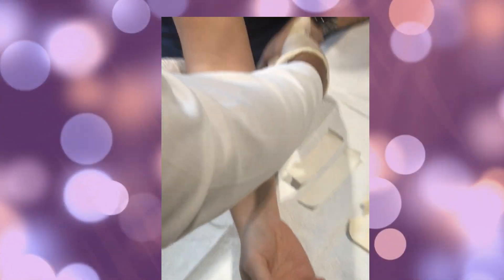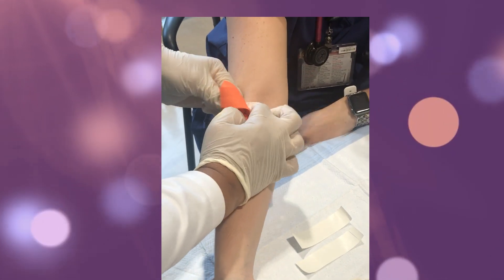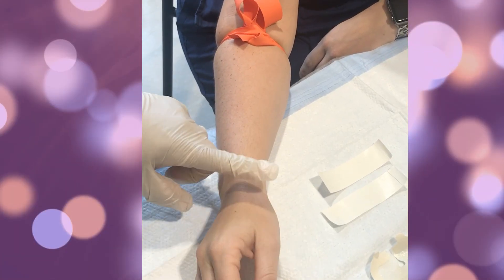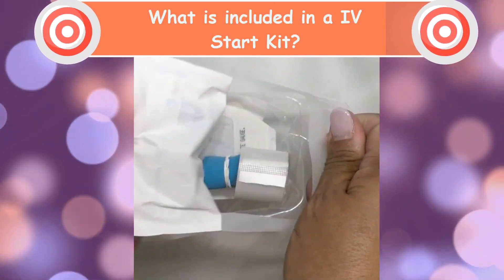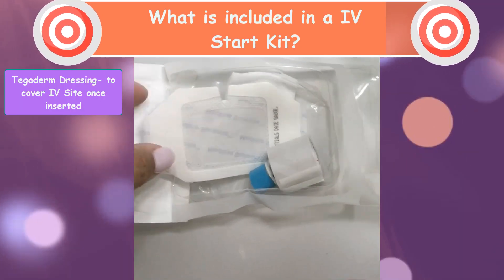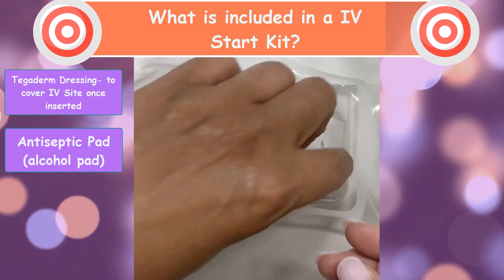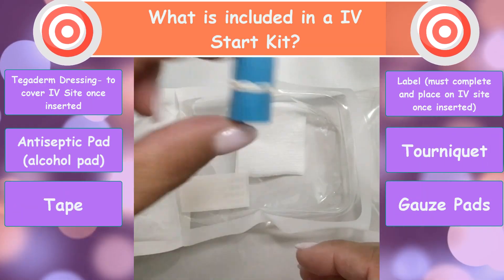The tourniquet is placed about two to four inches above the site you have chosen. One thing I do to help the vein plump up is tap it; you can also have the patient make a fist, which can help as well. What is included in the IV start kit: the first thing you'll see is the dressing or tegaderm, which will be placed over the IV site to secure it; the alcohol swab or scrub; the medical tape; and the tourniquet.